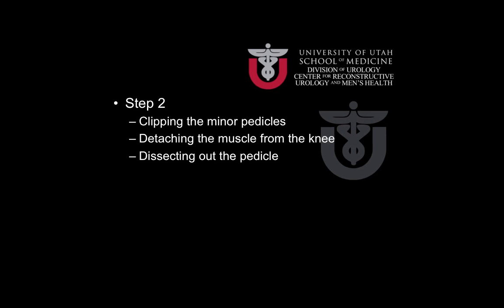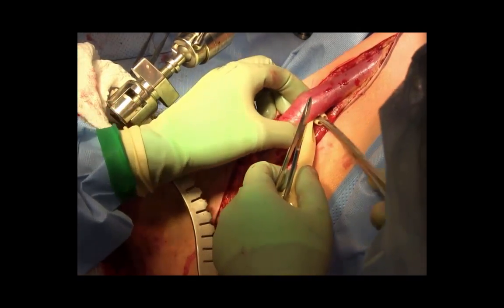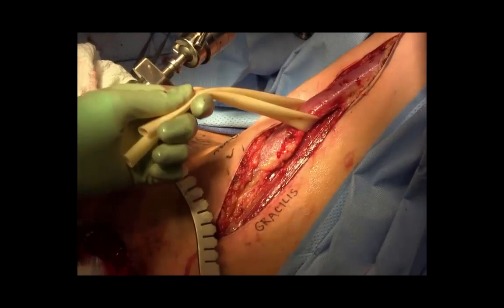In the next steps of the procedure, the minor pedicles coming in from the superior portion of the muscle are clipped along its length up to the major vascular pedicle. The muscle is detached from its tendinous attachment to the inner aspect of the knee, and then the large vascular pedicle is carefully dissected free. Here the gracilis muscle flap has been completely detached from the underlying musculature and a Penrose drain is passed around it to help in retraction.